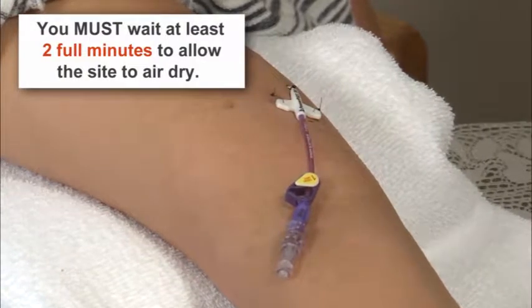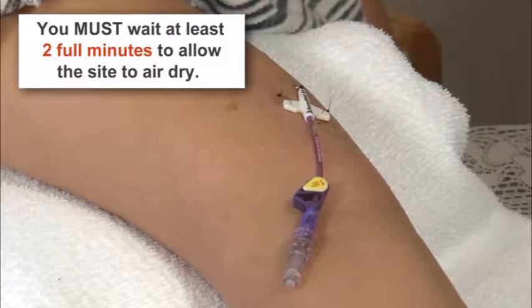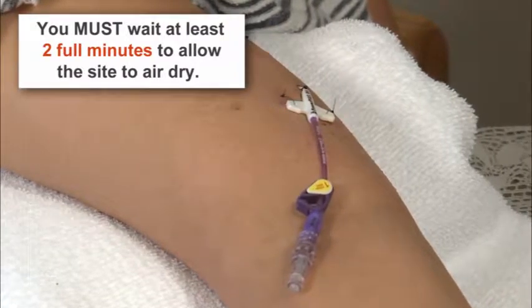Also, if a dressing is placed over the skin while it is wet, it can cause skin irritation, redness, and even blisters.